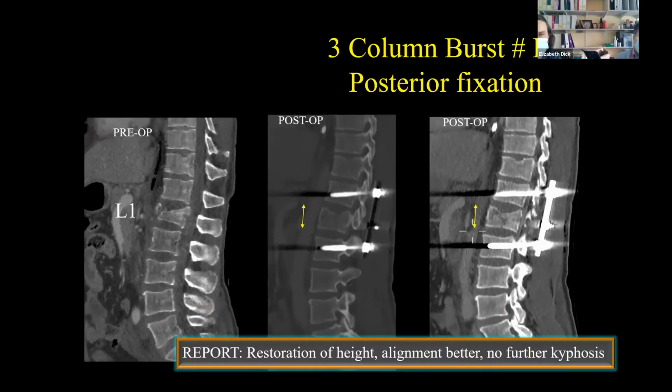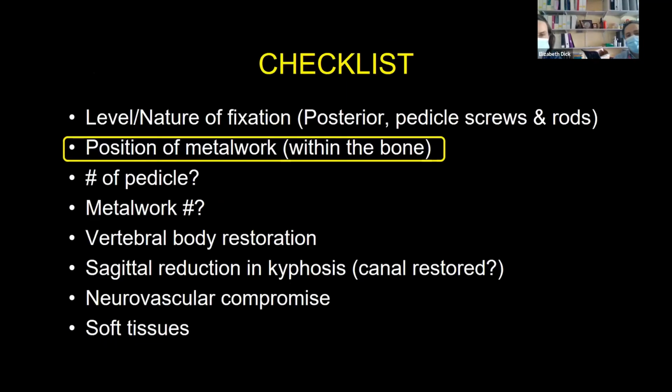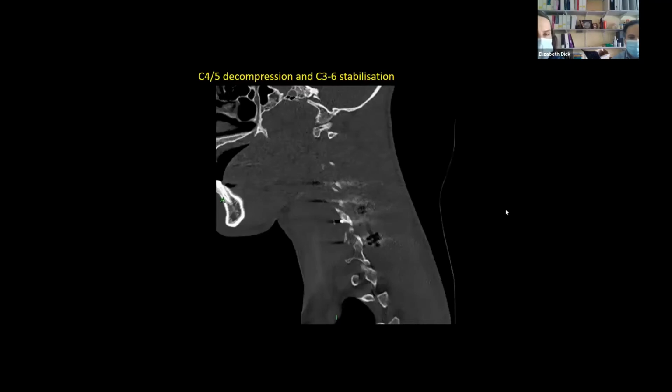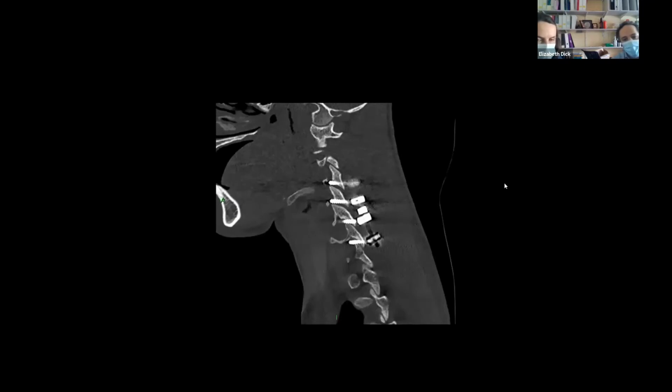Great, perfect. So let's move on now to our third patient. We're still thinking about metalwork in bone. Now this patient had a cervical spine injury. So the C5 vertebral body was burst, and there was also facet joint subluxation at C5-6. And we can see on the MRI that there has been cord injury. So this patient went on to have decompression and stabilization from C3 to C6. And we're going to run through these images as they appear on PACS.